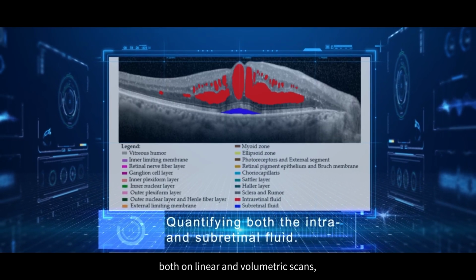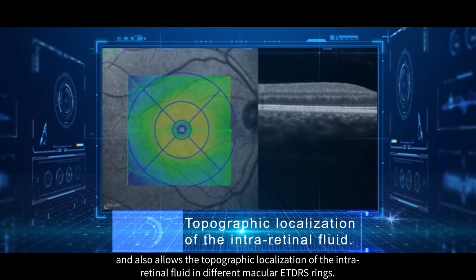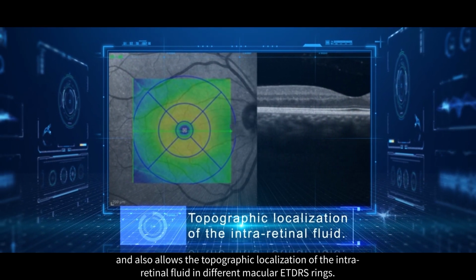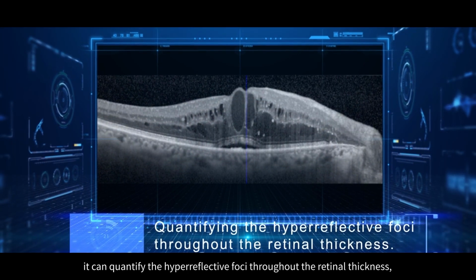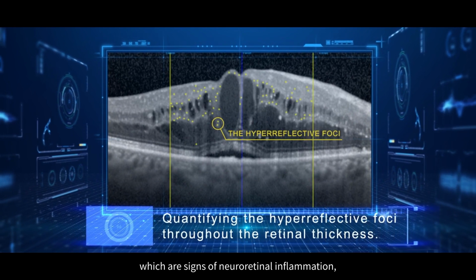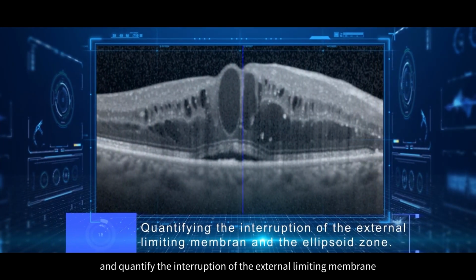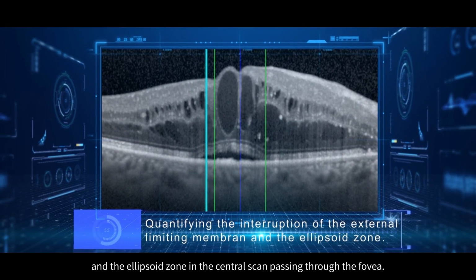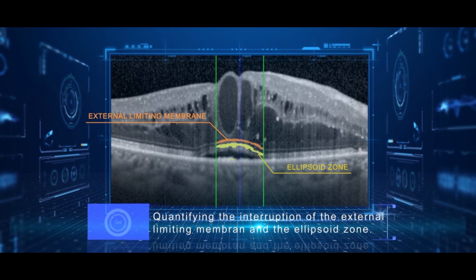on linear and volumetric scans, and also allows the topographic localization of the intraretinal fluid in different macular ETDRS rings. Furthermore, it can quantify the hyperreflective foci throughout the retinal thickness, which are signs of neuroretinal inflammation, and quantify the interruption of the external limiting membrane and the ellipsoid zone in the central scan passing through the fovea.